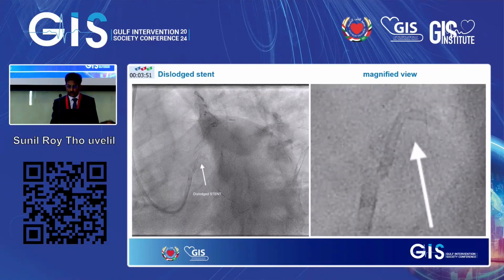We missed capturing that image, but finally this was the stent. We were trying to deploy the stent, but we were not able to push it, so we thought of taking it through a GuideLiner. While we tried to remove the stent, the balloon and the wire came out. We can see that there was some crimping.